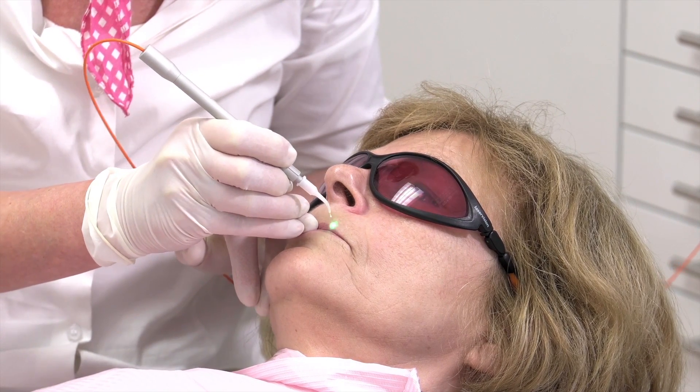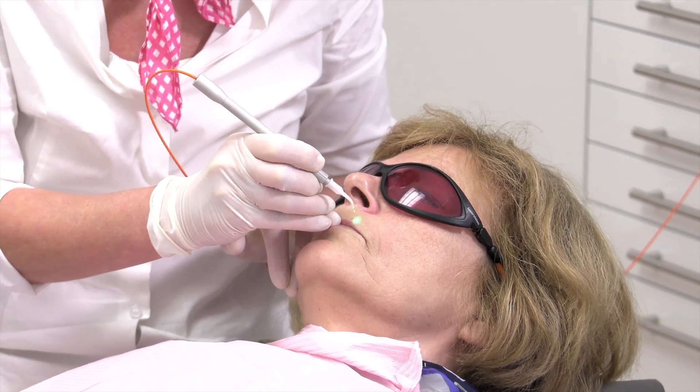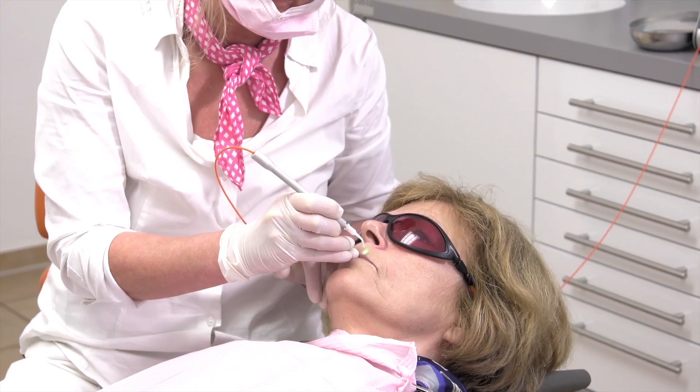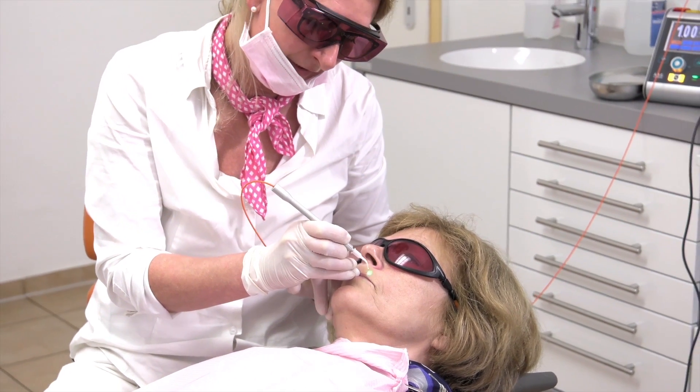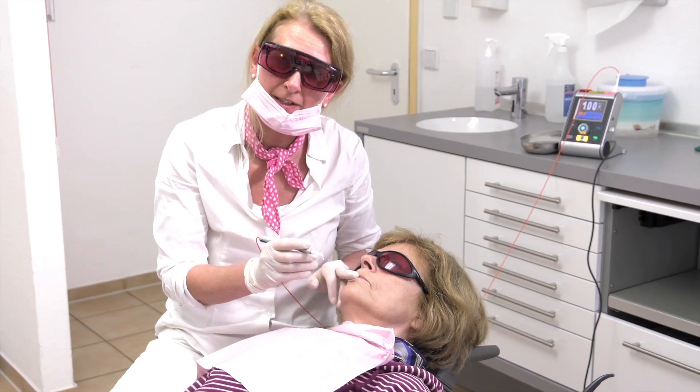And you can see the distance to the skin surface. We are already finished with the treatment. That's it.